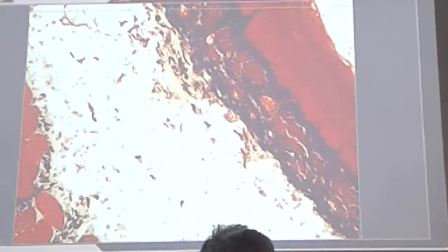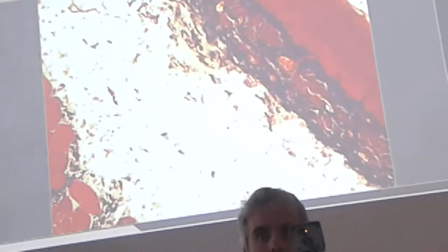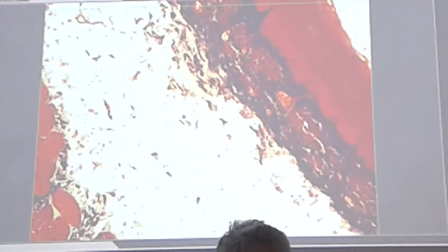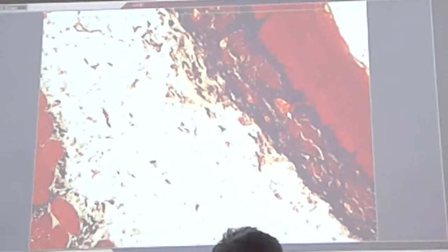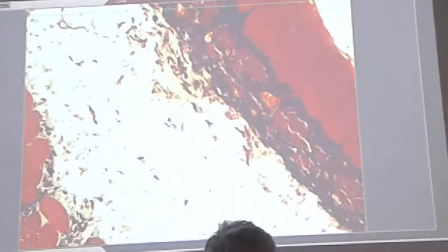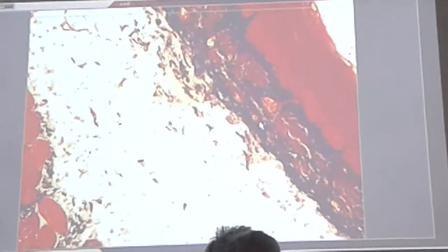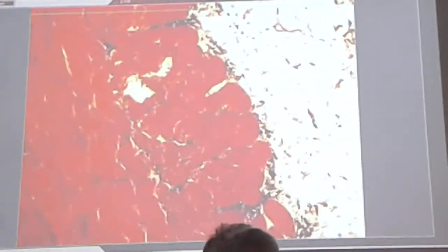Through the lamina propria, the individual bundles of muscle cells belong to the muscularis mucosa. They are also smooth muscle cells. Neighboring those bundles, you can still observe some blood capillaries or blood vessels, and there might be some neuronal endings as well.